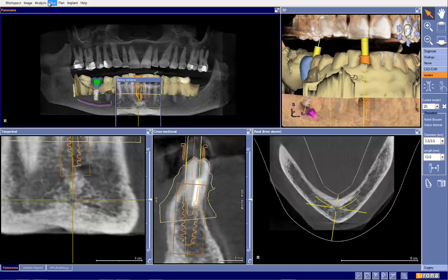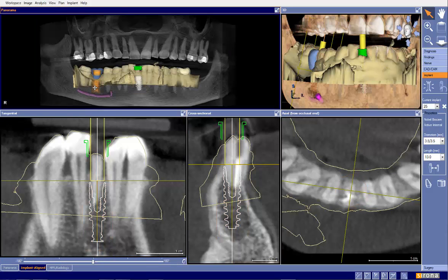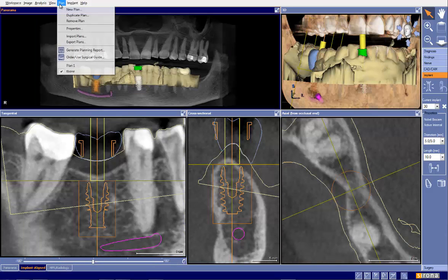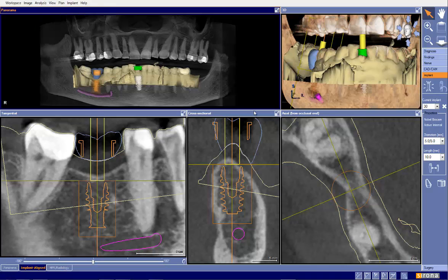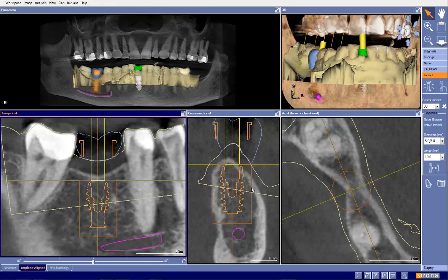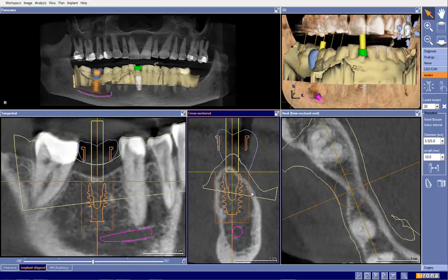We've been sent a case to evaluate an immediate placement on tooth number 25 and an edentulous area on site number 30. Let's go ahead and take a look at site number 30 first. I went ahead and duplicated the plan so we can compare at the end my plan versus the original plan.